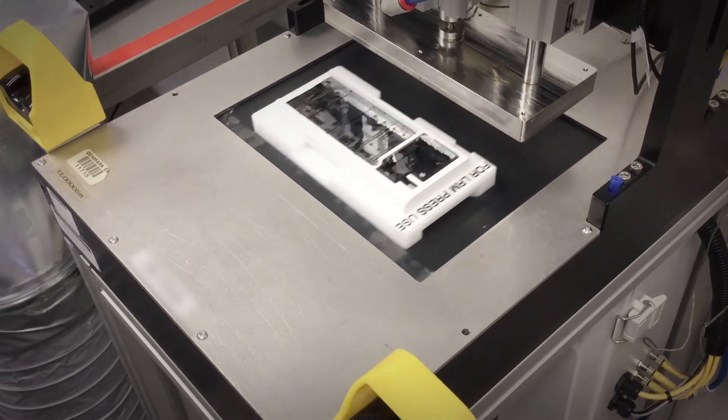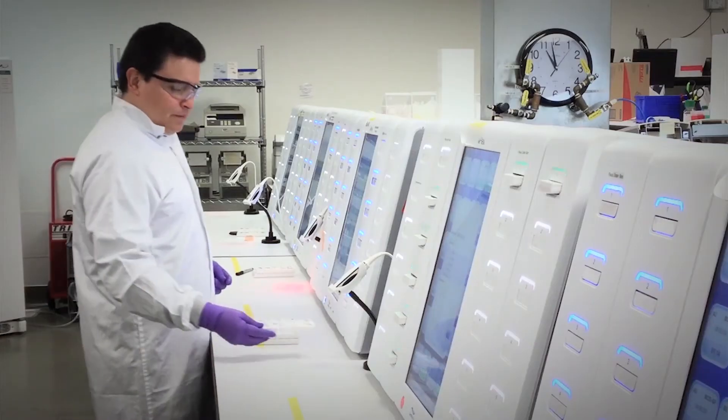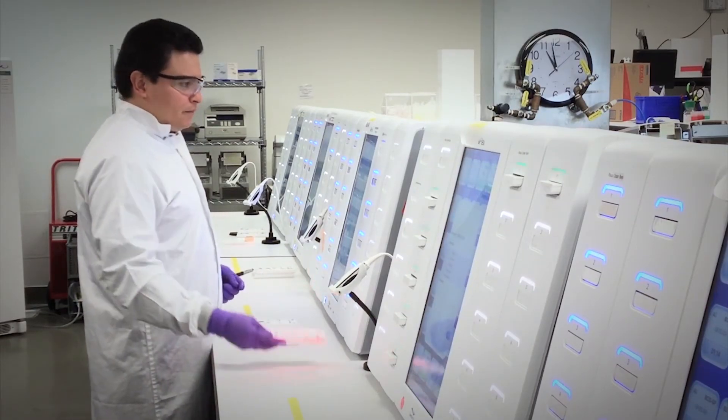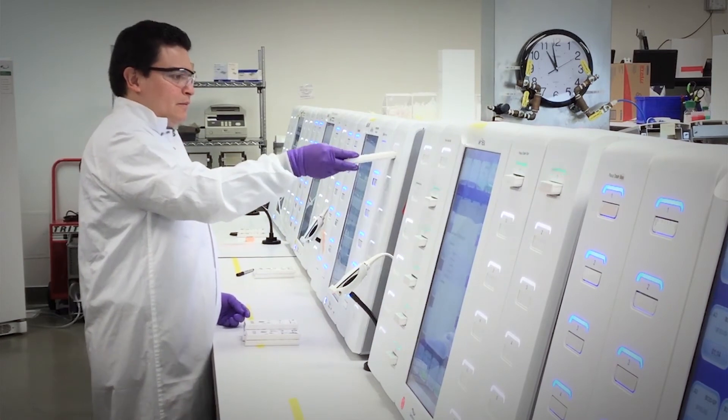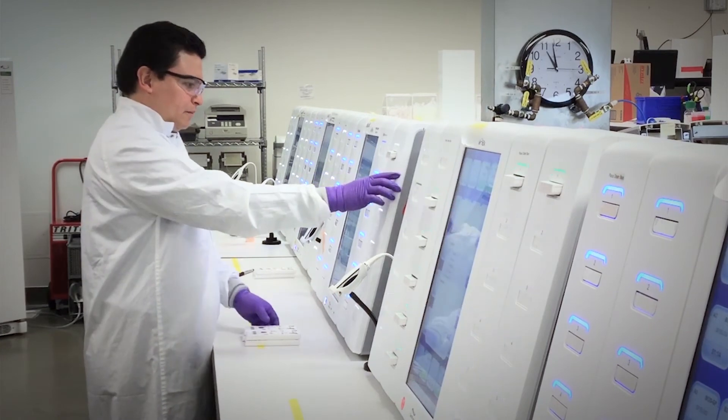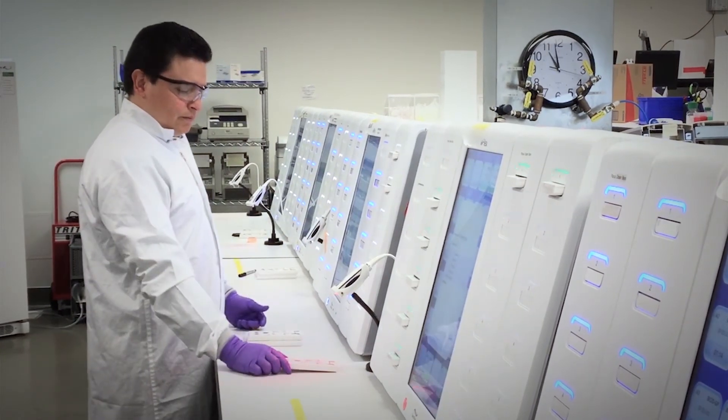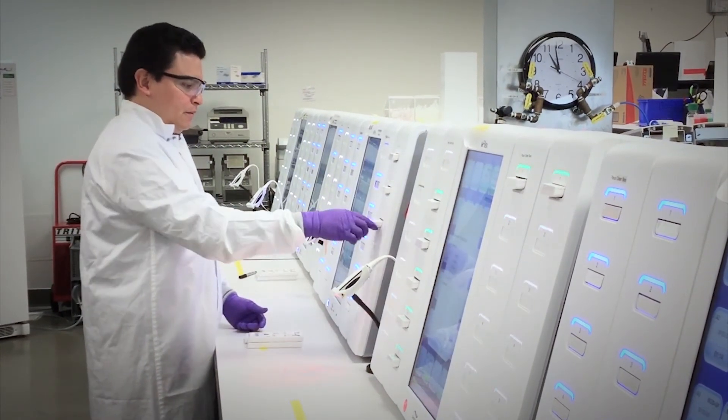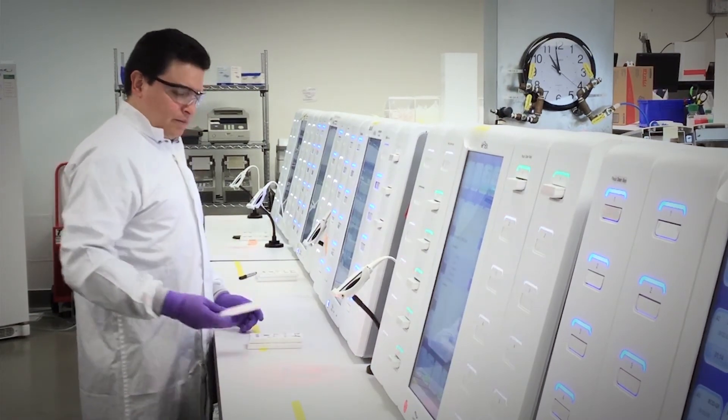Once final assembly is completed, a sampling of cartridges from each lot are randomly selected for a final quality check. We run the sampled cartridges through functional testing on the ePlex system using a quality control mix that has predefined positive and negative targets. This final QC check allows us to ensure manufacturing lot quality before shipping to customers.